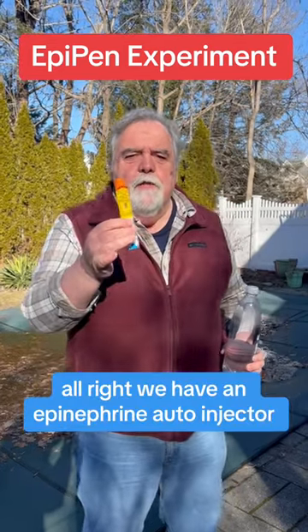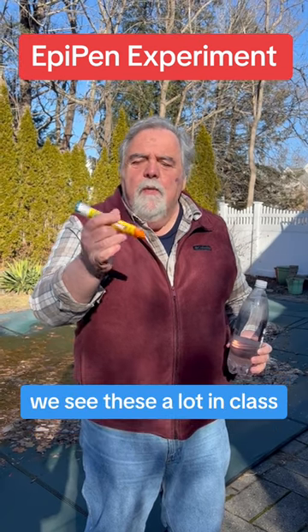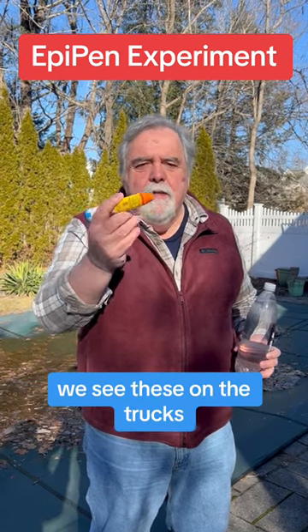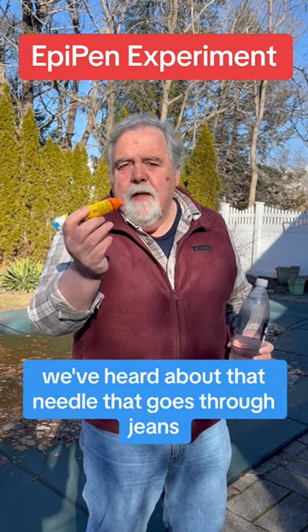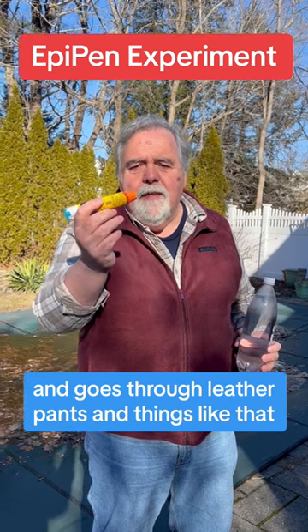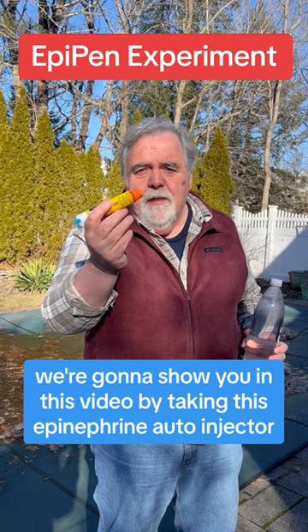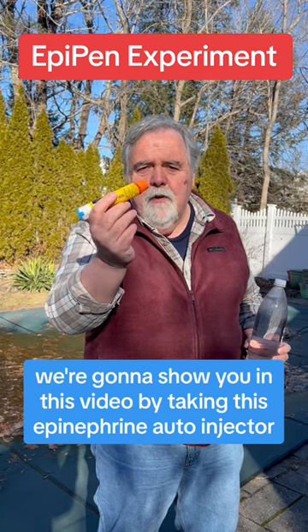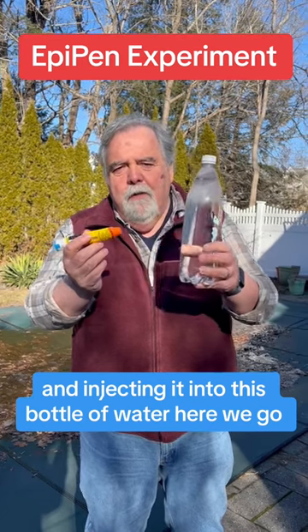We have an epinephrine auto-injector — 0.3 milligrams in this adult auto-injector. We see these a lot in class and on the trucks, but we don't use them a lot. We've heard about that needle that goes through jeans and through leather pants. How big is that needle? How much fluid comes out? How does it work? We're going to show you in this video by taking this epinephrine auto-injector and injecting it into this bottle of water. Here we go.